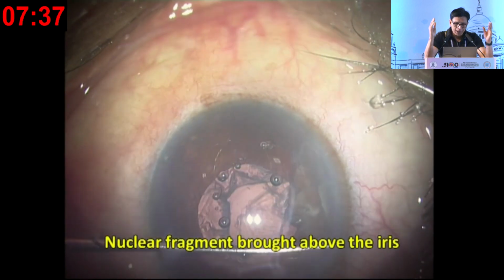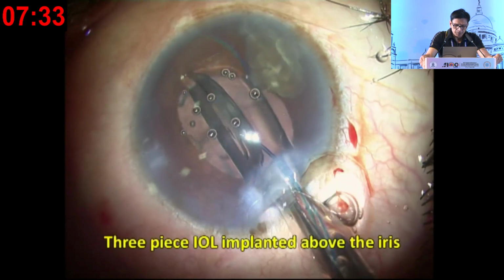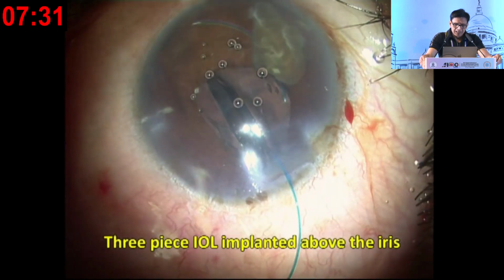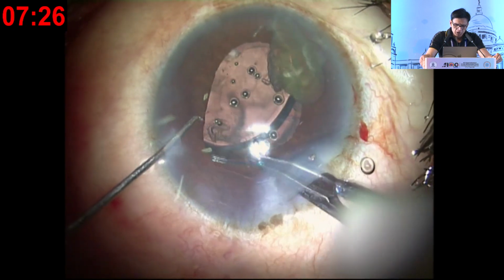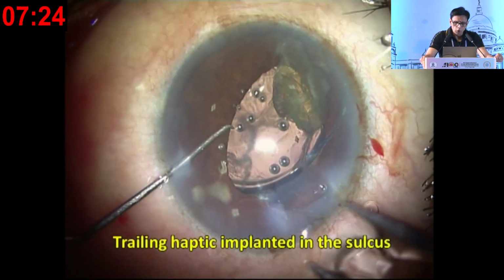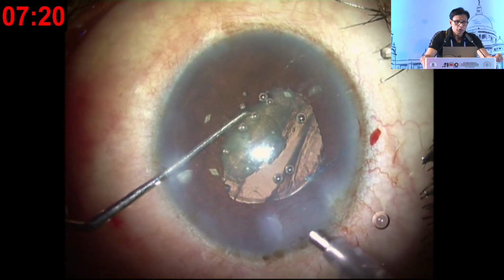So I do not know, perhaps some jerk has created it. A small fragment has been left behind. So I thought, let it remain behind. Let me be safe. Put the IOL inside. So all of you, if you master this scaffold technique, it will help you a lot in such cases, because now the IOL acts like a posterior capsule.